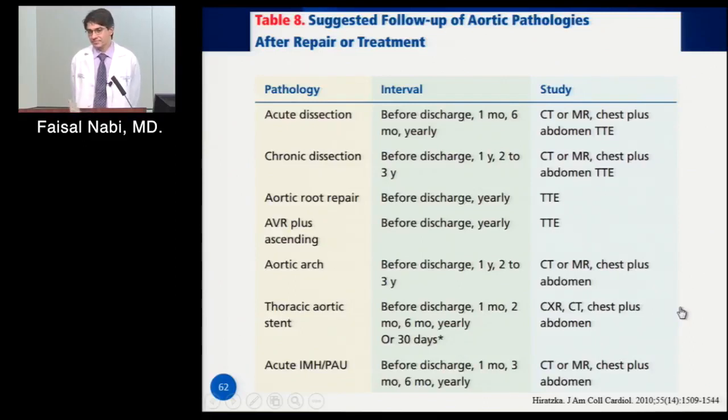One question is, when you're following these type 3s, or type 1s that were converted into type 3 after surgery, what are the criteria for elective intervention in terms of expansion? Are there some magic numbers there? That's a great question, Dr. Q. I'm not sure. I'll fess up right there.